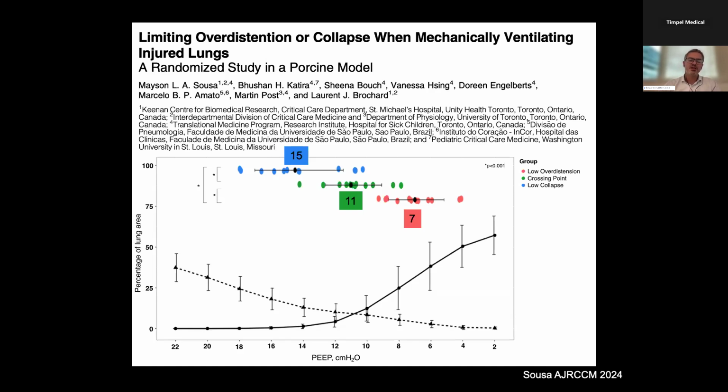So we switched gears a little bit to focusing on, and having as a goal, an optimized lung mechanical situation, which is much more in line with the concept of optimized driving pressure. Because both collapse and overdistension induce some derangement of lung mechanics, and both of them can force you to apply higher driving pressure.